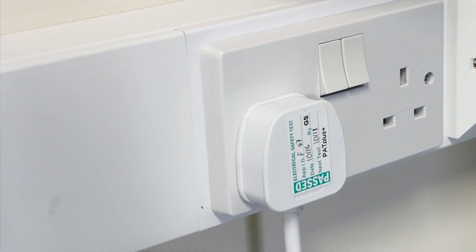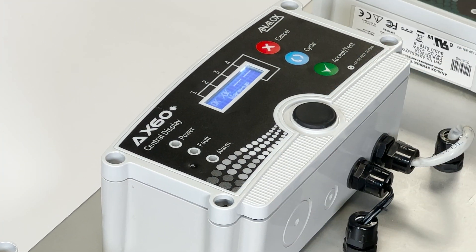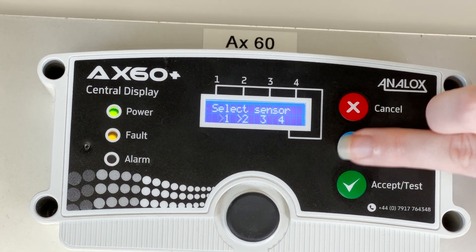To fix this problem we must first power cycle the device. This can be done by switching the power off and on again. This is done because we need to check if the fault is an old or a new code. If it's old it will clear once it resets. Wait for the device to start up. Once it is complete you will be able to see the sensors displayed on the screen.